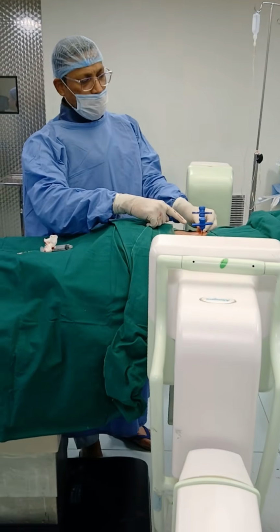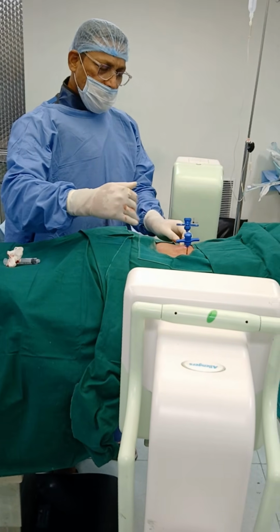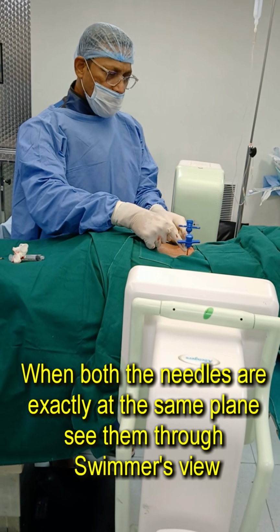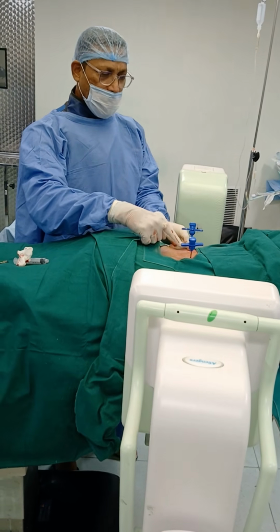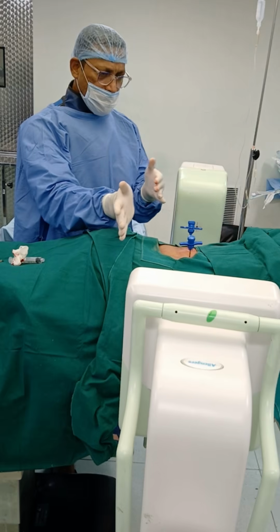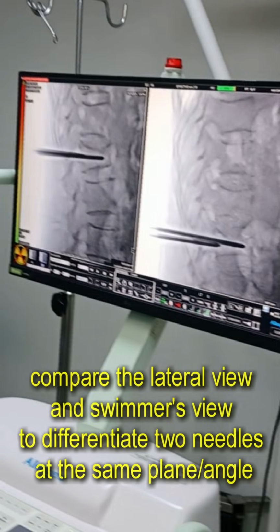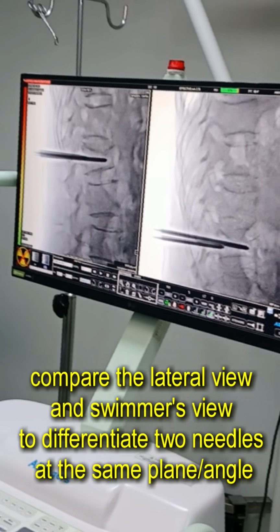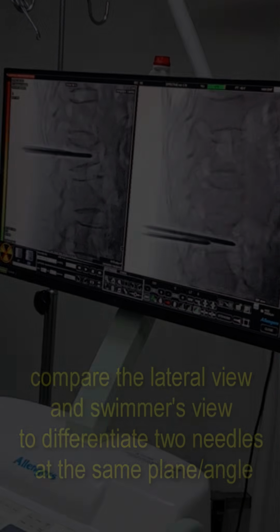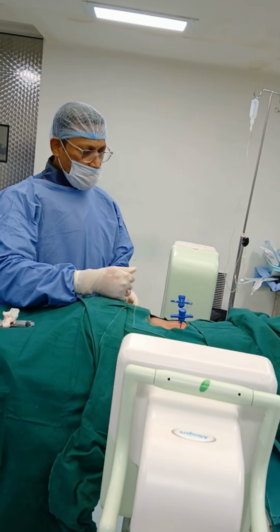Get both the needles on the same line. Then, to see the needles' depth, we can make the C-arm a little oblique, a swimmer's view kind of, so that we can see both the needles. They will not be in the same line in the picture, but actually they are in the same line. So we will take the C-arm a little oblique from the lateral view, and you can see both the needles. What is the depth there? Okay, now again we will take the C-arm in the real lateral position and we will progress the needle.